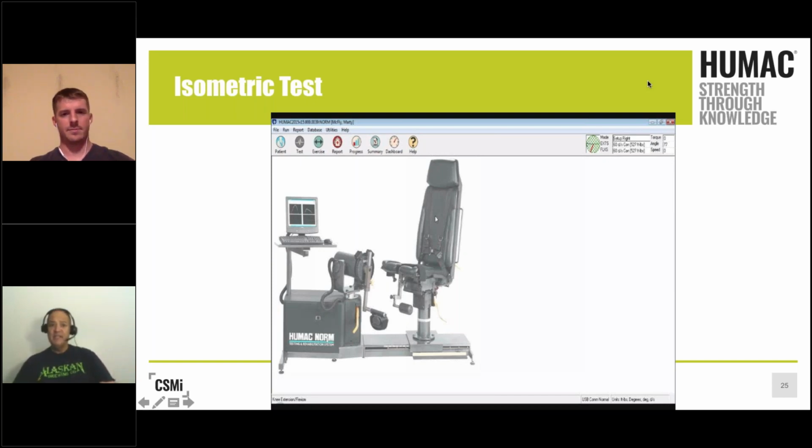And so we may see that with our post-surgical patients, with anyone that has an injury, any type of inhibition associated with that. And so paying attention to the quality of the contraction through the range of motion is important to me. And that's going to be picked up a lot next month as well. Again, today we're talking isometrics as a way to track those early strength gains. But John, you test your total knee patients eccentrically, isokinetically. Is that safe?